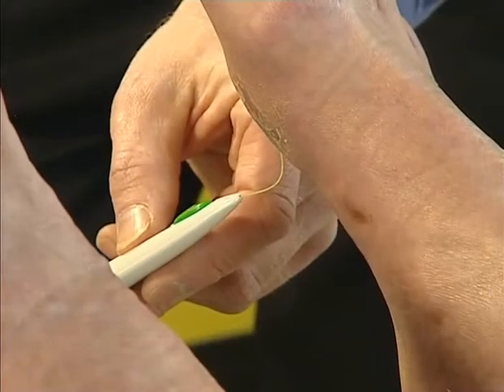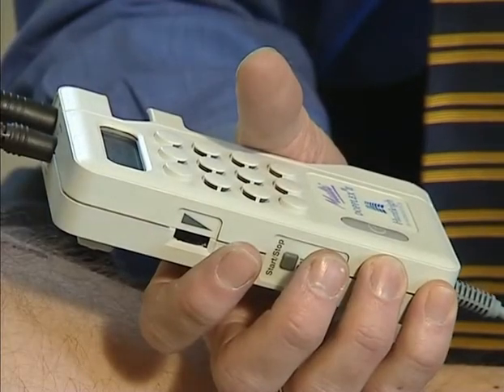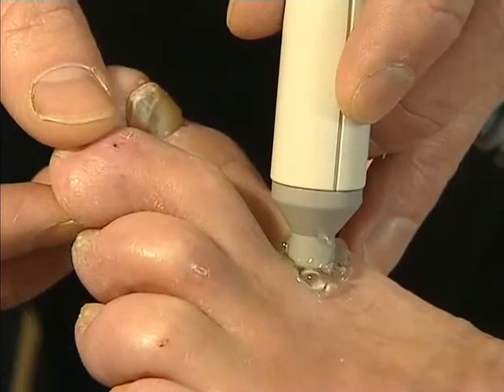This video showing a basic diabetic foot assessment should enable you to identify the at-risk foot. Remember, this is only the first step in prevention of foot ulcers and lower limb amputation.